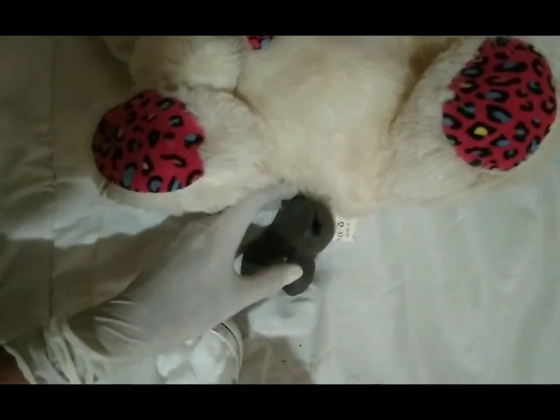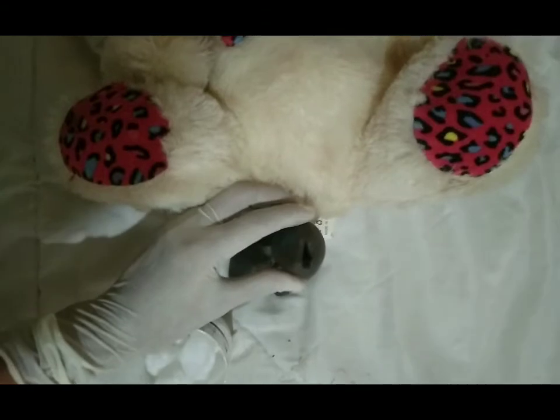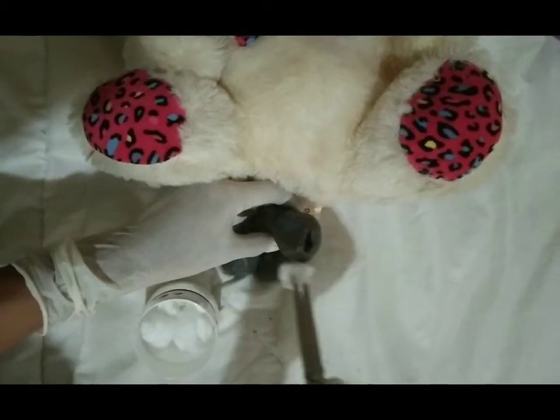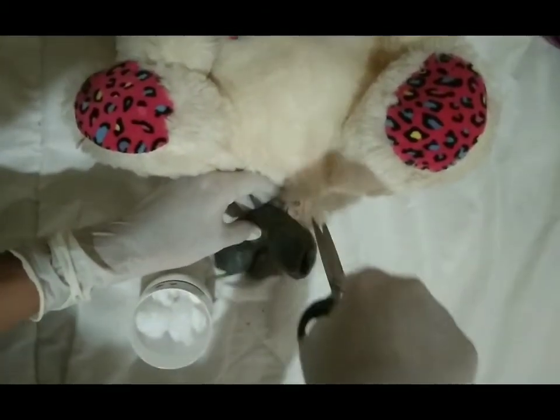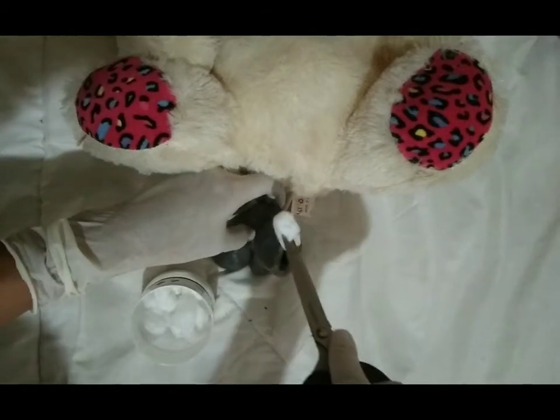So we will hold the penis of the patient, and if the patient is uncircumcised, you will hold the skin like this. Take a 70% solution cotton, and we will use circular motion on the skin of the patient. So we will remove that cotton and take a new one.